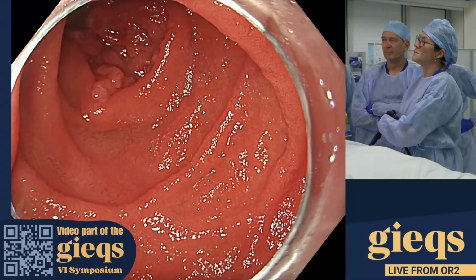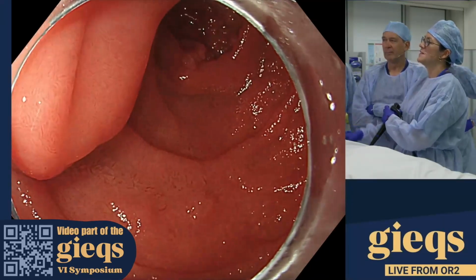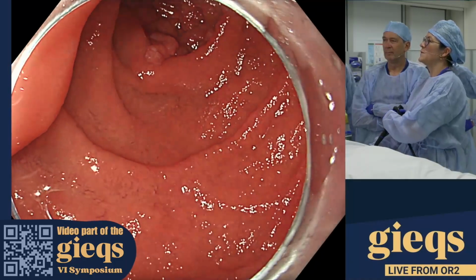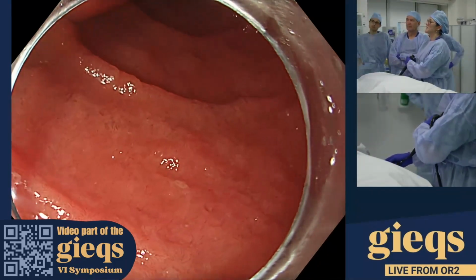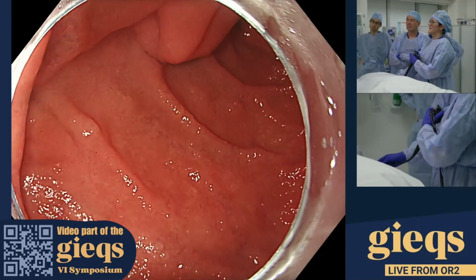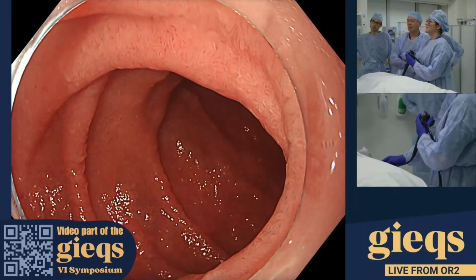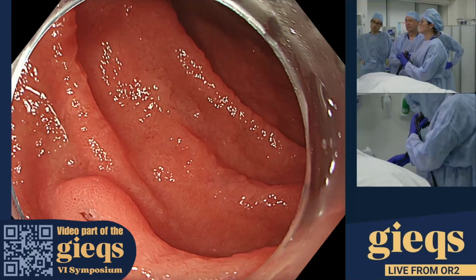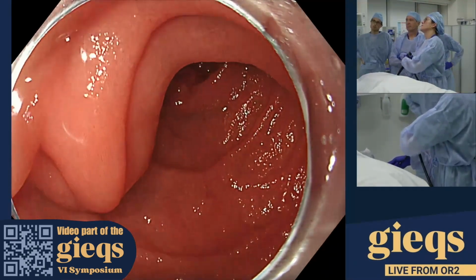We flushed down some simethicone, and I was just hanging in here a bit because we see the lesion in the back, but I was trying to identify the papilla, which was a bit up there, and then we saw something interesting a little bit more back. So the papilla's just gone past at 11 o'clock. And then we've got this on the floor. Here's some ectopic pancreatic gland, pancreas. And the papilla was up here.